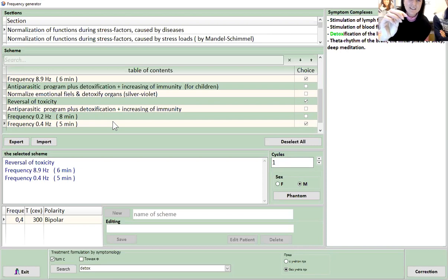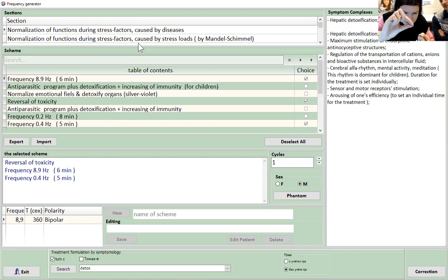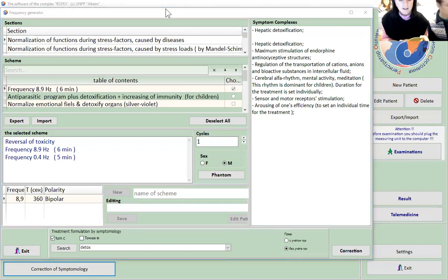Yeah, because why do we use these magnetic stripes, why are they called magnetic? Because on top of this band, there are small particles of metal. So if you touch them, they will disappear. Right, I can see that.